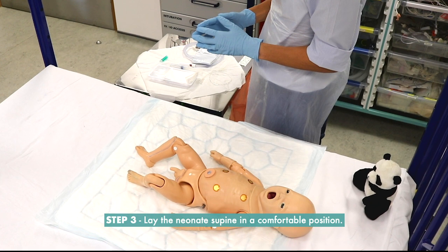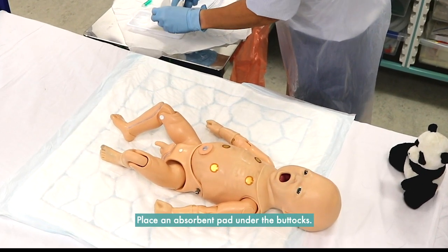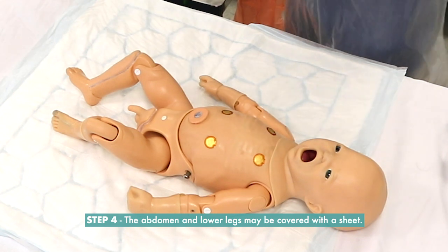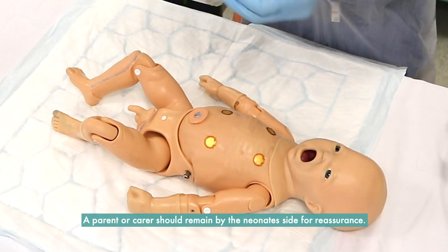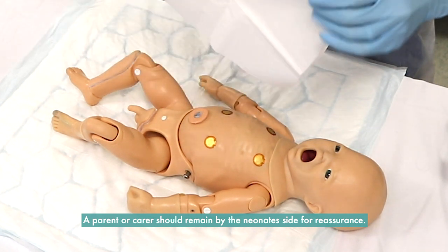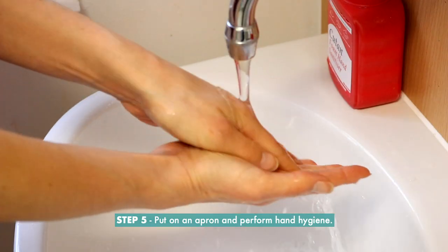Step 3: Lay the neonate in a comfortable position and place an absorbent pad under the buttocks. Step 4: The abdomen and lower legs may be covered with a sheet. A parent or carer should remain by the neonate's side. Step 5: Put on an apron and perform hand hygiene.